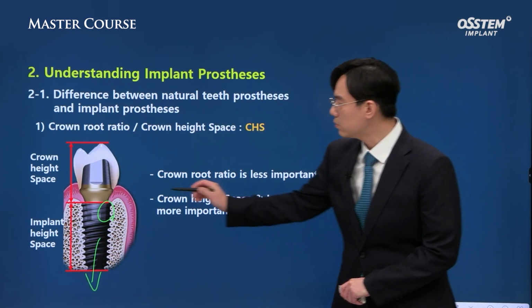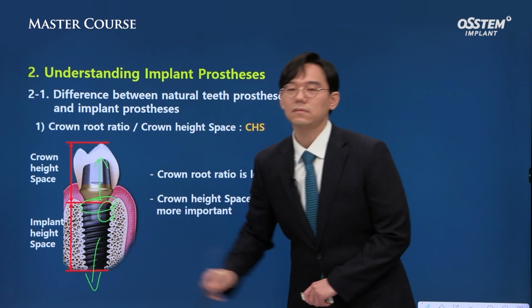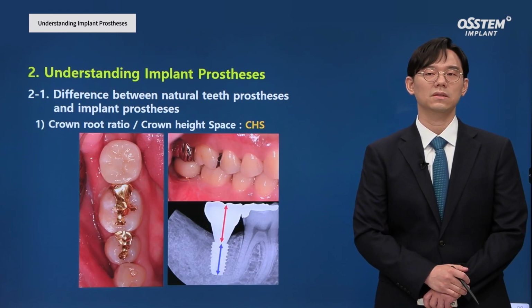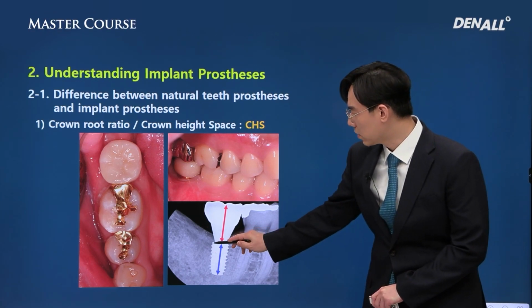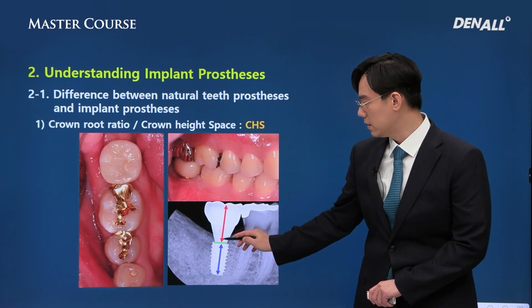Just because the length of implant continues to grow does not mean increased stability. What is more important is the length of the superior crown and diameter of the implant. In the case of internal conical connection implant, like TS, the implant and abutment margin is used to divide crown and root.